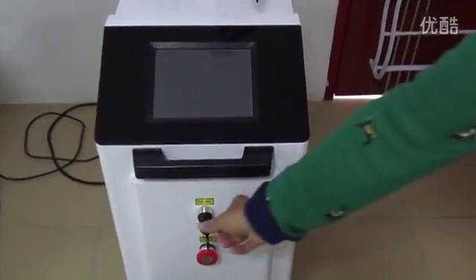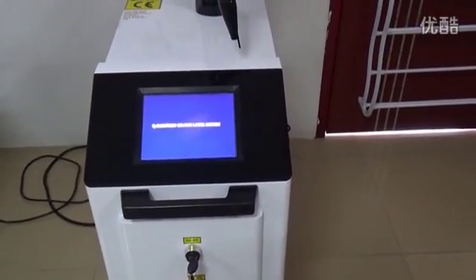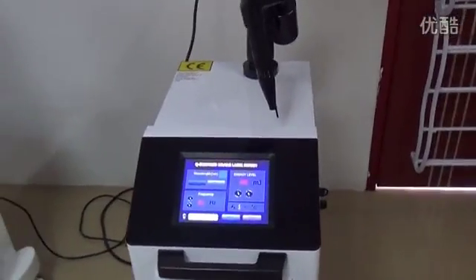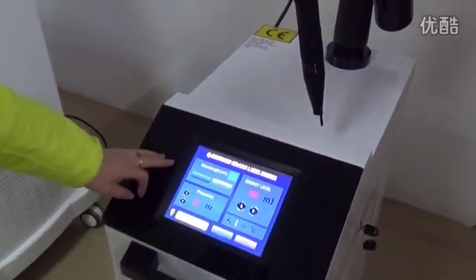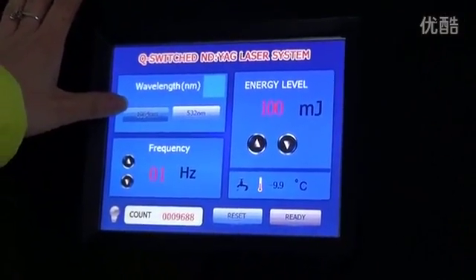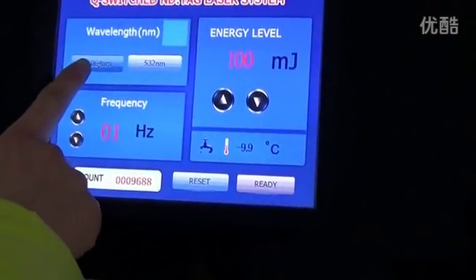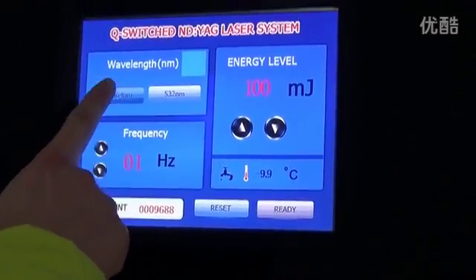Now, the skin operation. Pin on the machine. Press this button. You can choose the 1064 wavelength.